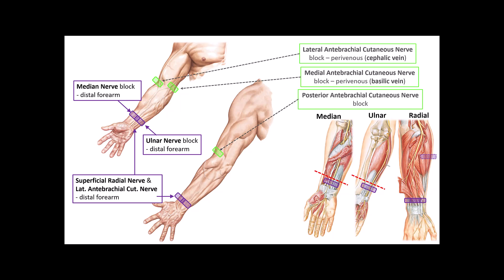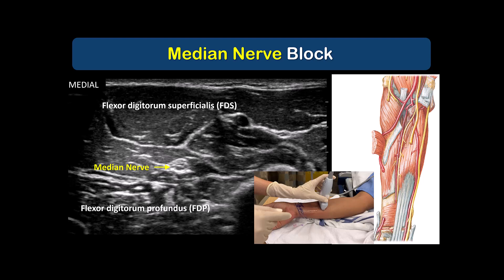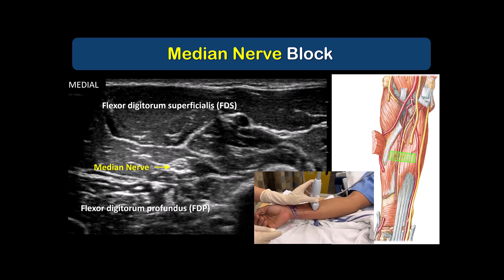I'll now briefly describe my recommended techniques for blocking the four principal nerves. I usually start with the median nerve. The patient's forearm is supinated, and the probe is placed in a transverse orientation on the ventral aspect of the forearm to locate the nerve. It lies sandwiched between flexor digitorum superficialis and profundus. It can sometimes be anisotropic, which means the nerve can blend visually into the muscles. So if you don't see it, tilt the probe one way then another, and the nerve will light up.